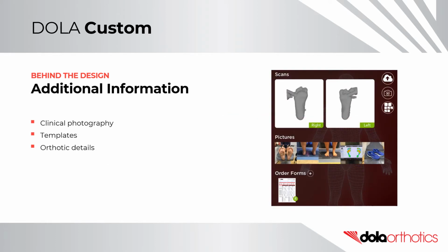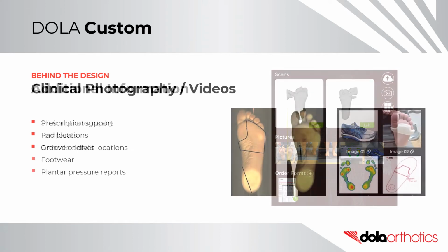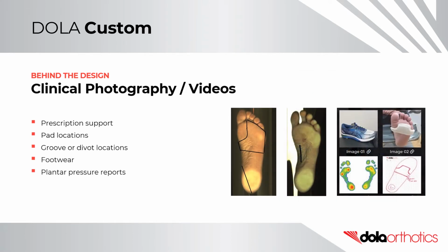The more information you can provide to your orthotic lab, often the better the orthotic outcome. Additional information that we commonly receive includes clinical photography, templates, and previous orthotic details. We regularly receive clinical photography or videos from our clients. This allows us to help with prescription support or provide details on pad locations, groove or divot locations, additional footwear information, or provide plantar pressure reports.